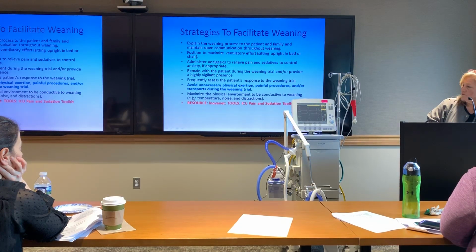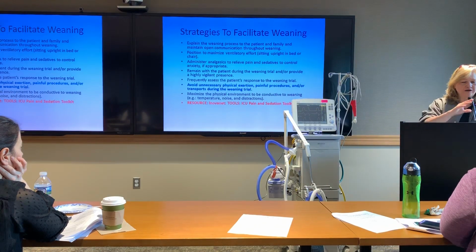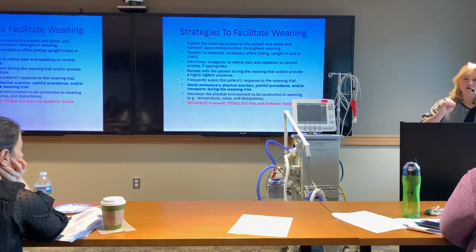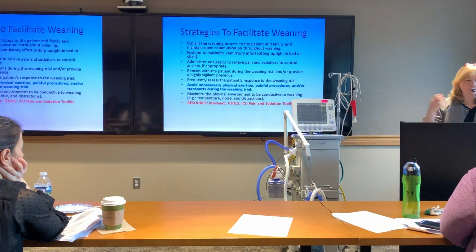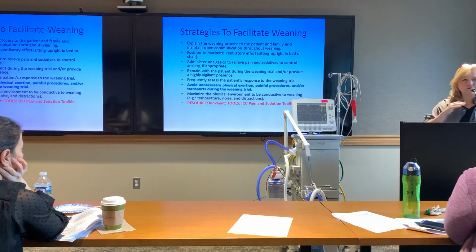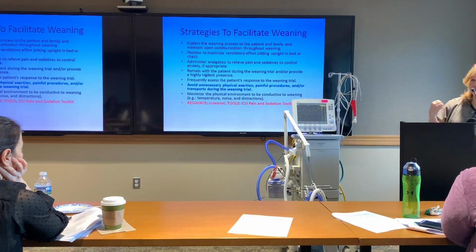All right. Avoid unnecessary physical exertion. Okay, so if you guys haven't done your morning care for the patient, don't start the breathing trial, okay? Or if you haven't done the morning care and they really want that breathing trial done, hold off on turning the patient and cleaning him up and putting on new gowns and bathing him until the trial's done, okay? Let's give the guy a break, give him every opportunity to pass instead of fail. So coordinate your plans accordingly. Try not to be doing busy work while they're just needing to breathe.